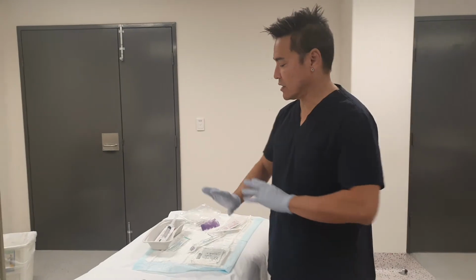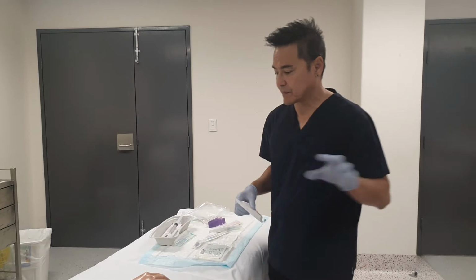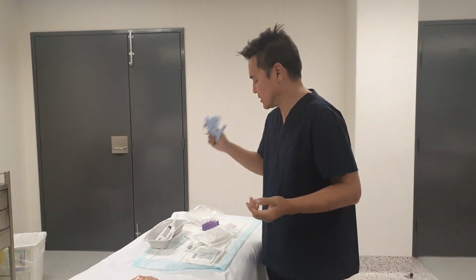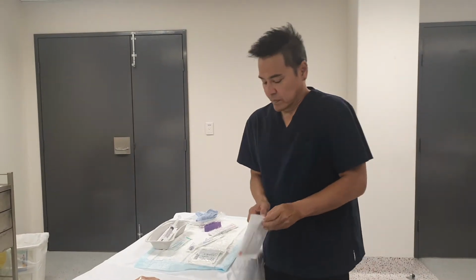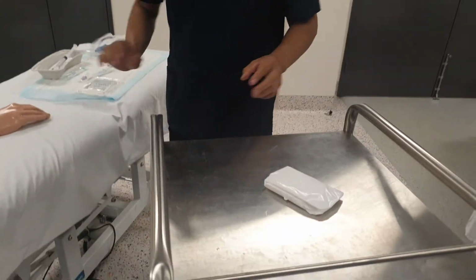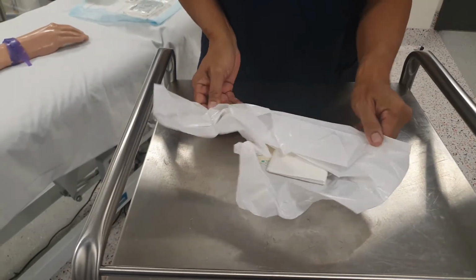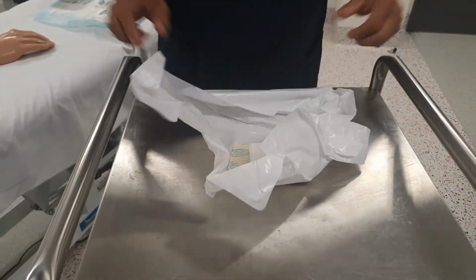Okay, so now that I'm ready to go, I'll get everything ready on my dressing trolley just for the purposes of this demonstration. So I've touched my patient with these procedure gloves. They're grubby now. I'm going to open up my pack. So remember when we did aseptic technique, it was being very careful about how to open up the pack and careful not to contaminate the interior contents of the pack. So you can touch the outside, don't touch the inside.